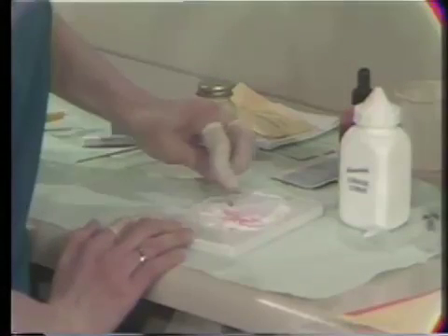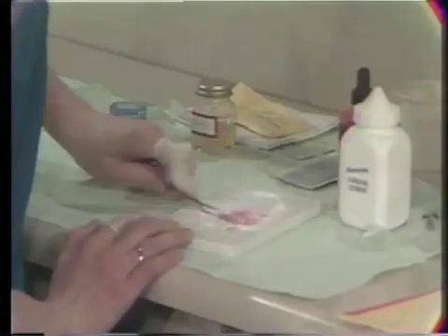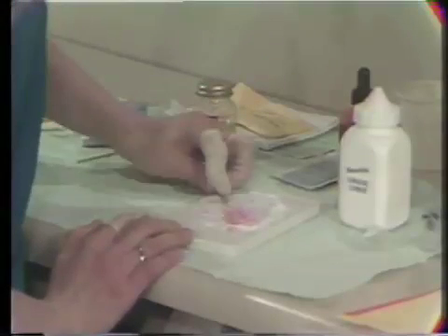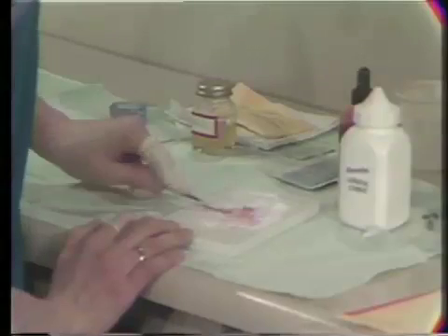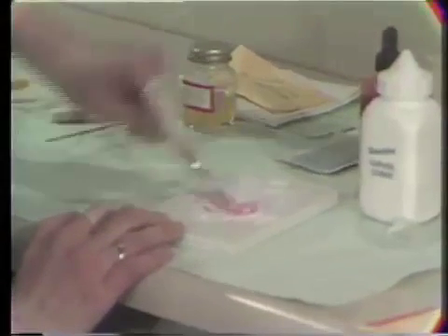And you can see how Betty's adding more powder to the dressing material now, getting it gradually more thick. And since she's done this many, many times before, she knows the consistency that's necessary, and she'll continue to add powder until it gets to the right consistency.